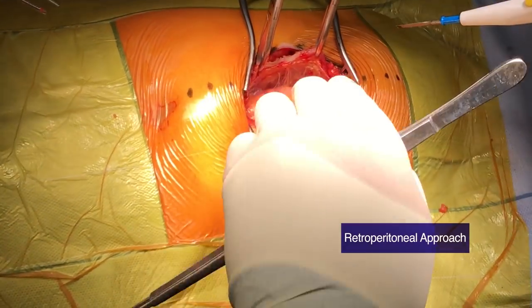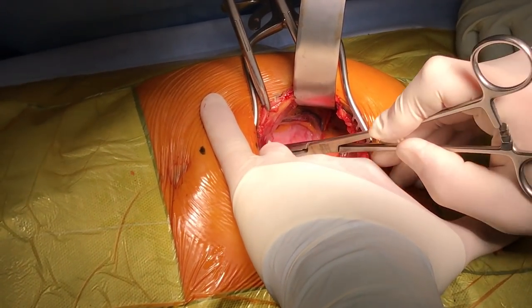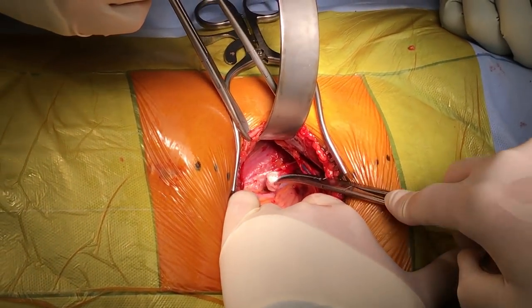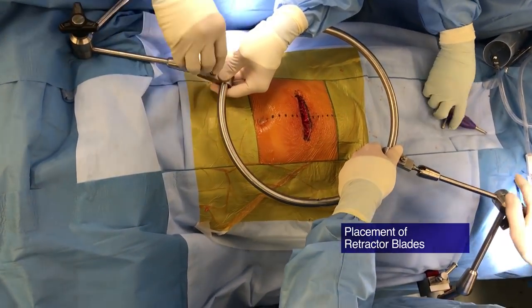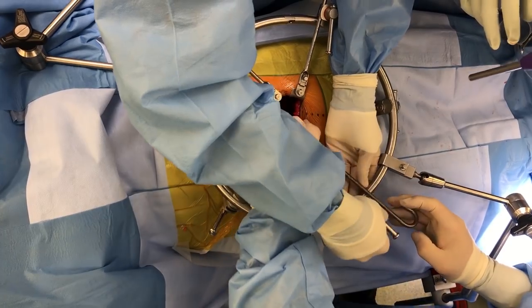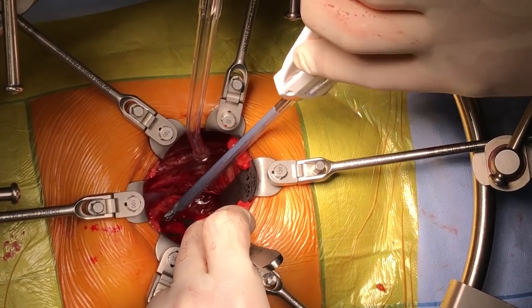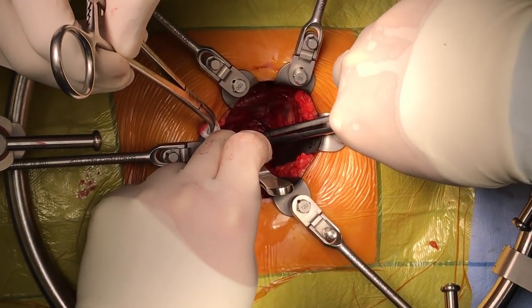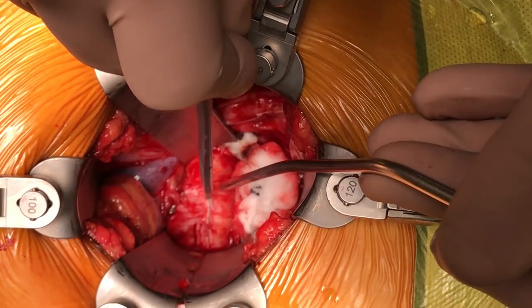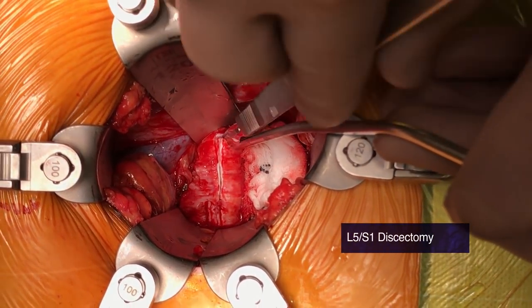Blunt dissection is used for this part of the procedure. The inferior epigastric vessels are visualised, preserved, and retracted anteriorly. The main structures we visualise are the psoas muscle and genitofemoral nerve, and as we dissect out the vessels we can then put in the retractor system using low profile narrow blades. The iliac artery and vein is exposed, the median sacral vessel is double clipped and divided, and blunt dissection is used over the anterior disc space. An incision spanning the full exposure of the anterior aspect of the L5-S1 disc is performed.